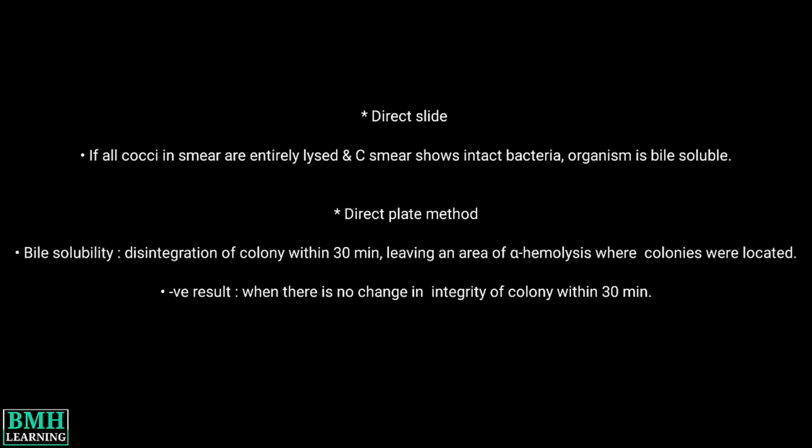Direct plate method. Bile solubility is demonstrated as disintegration or flattening of the colony within 30 minutes, leaving an area of alpha hemolysis where the colonies are located. A negative result is demonstrated when there is no change in the integrity of the colony within 30 minutes. This was all.